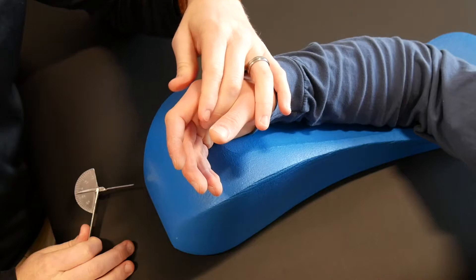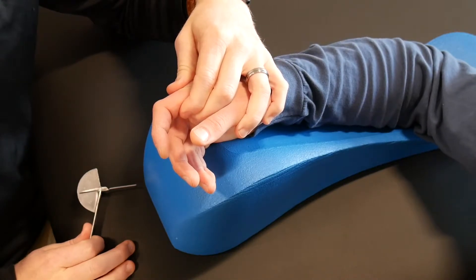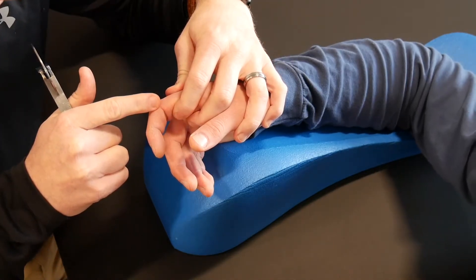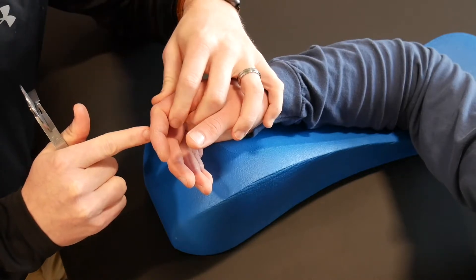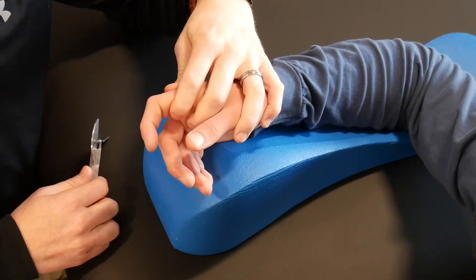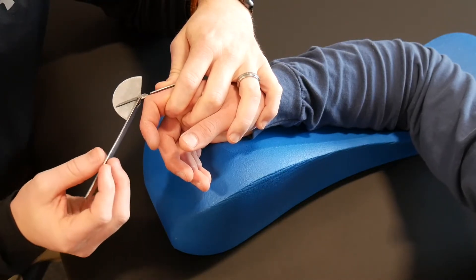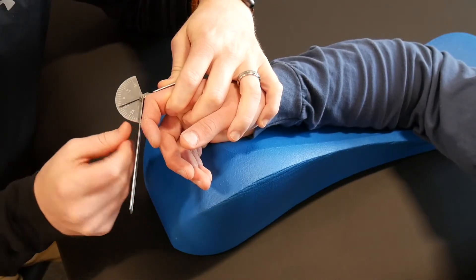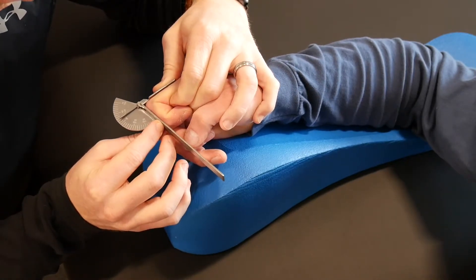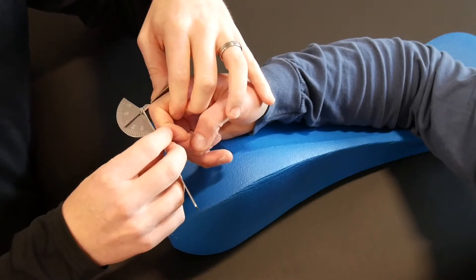When you go up to the PIP joint, I like holding the MP joint in a little bit of extension, then supporting right here at the proximal phalanx. Make sure you are clear of the PIP crease — if you're here and you ask them to flex, they're going to run into your finger and it won't be a true measurement, so clear that PIP crease. The stable end goes right on the proximal phalanx this time, and your movable end is on the middle phalanx. Ask the patient to bend as far as they comfortably can. He's got normal motion — right around 105; anywhere between 105 and 110 degrees is typical.